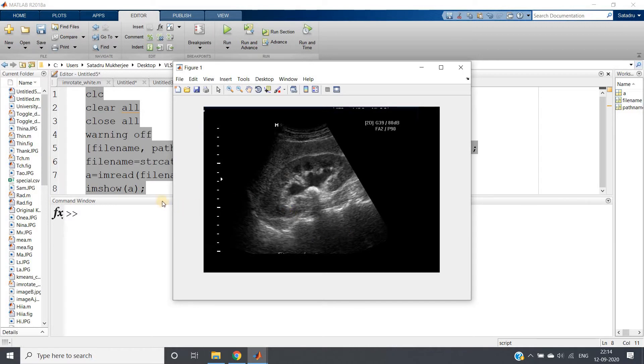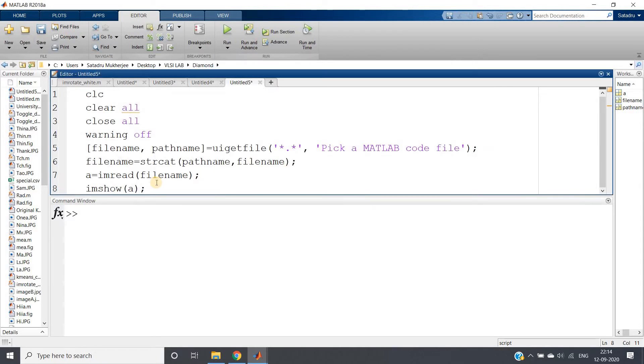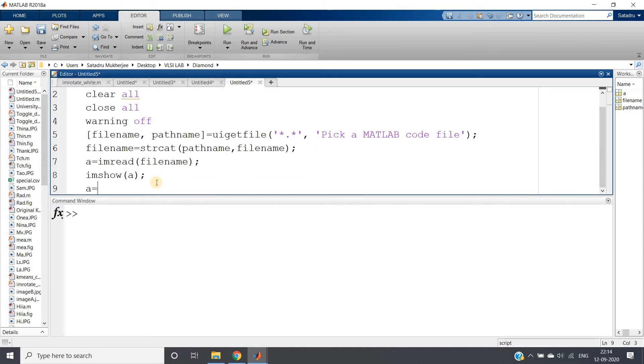So we need to create one proper mask which we can put on this particular image to remove all this and keep only our point of interest. So what we can do? Obviously creating filter. Logical operation you can understand quite simply in case of binary domain. So we will convert our image from RGB to grey and grey to binary.